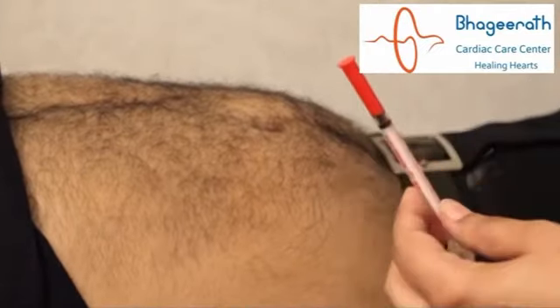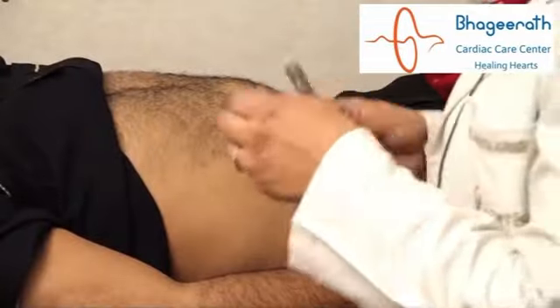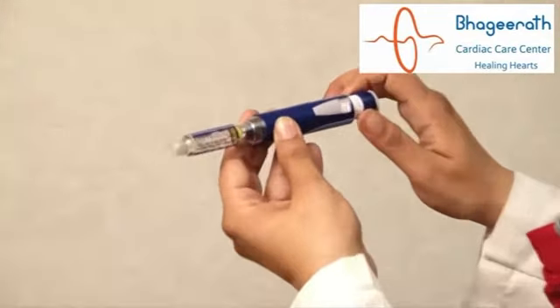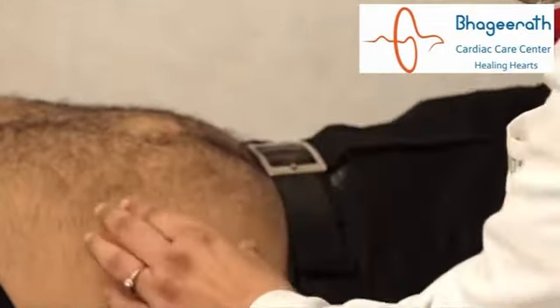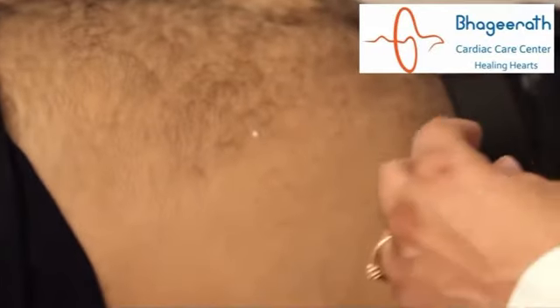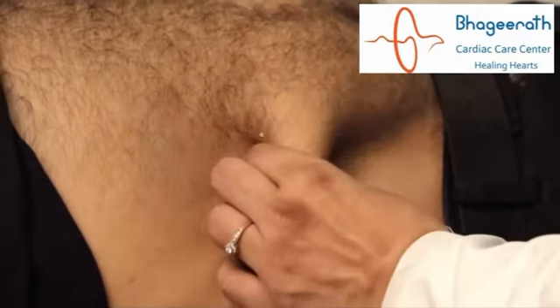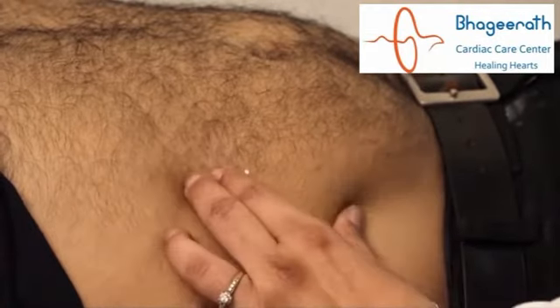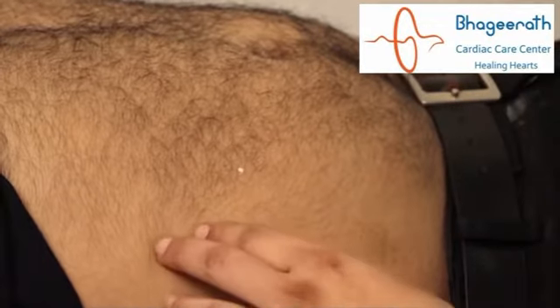When using a syringe, you should always make sure the patient uses the correct color code of the syringe. When using a pen, you should dial the desired amount of insulin, say 20 in this case. Now you have the site ready, you just have to pinch it. Pinching requires just 3 fingers and you pinch slightly. You don't have to dig deep and get the muscle out. You just want some subcutaneous tissue, so you can inject the insulin. Just pinch it slightly and make sure that the injection and the pen go straight in at 90 degrees.